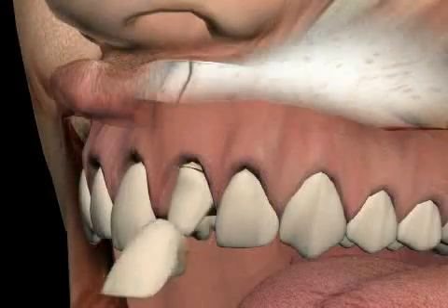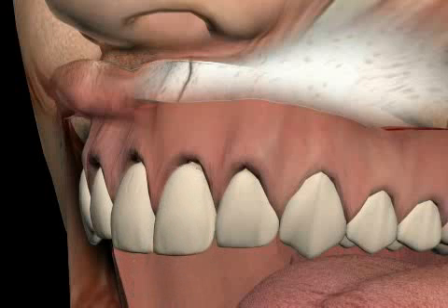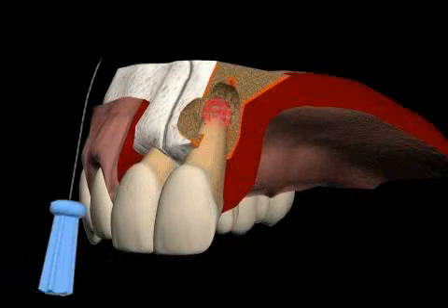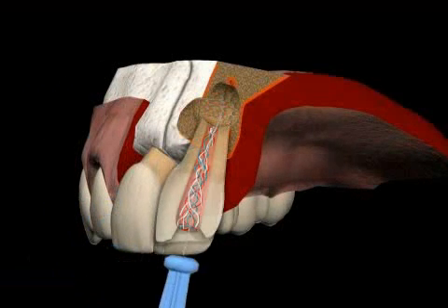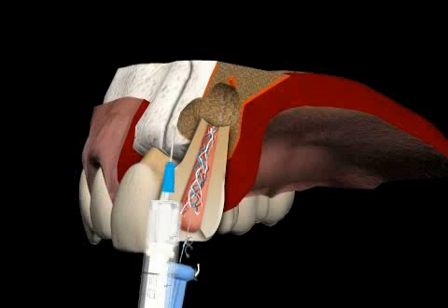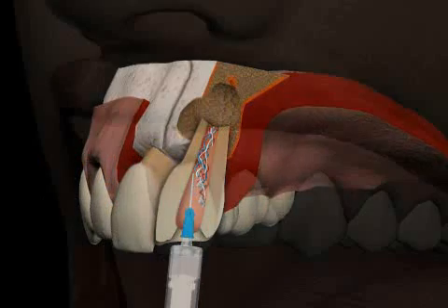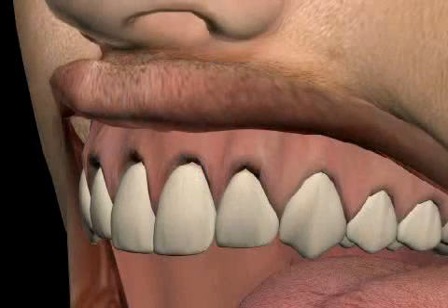The patient has frontal teeth crowns. After a few years, he developed infections at the root tip caused by bad root treatment. In the past, a root tip resection without orthograde or retrograde filling was performed. Today is a repeat root tip resection with retrograde filling.